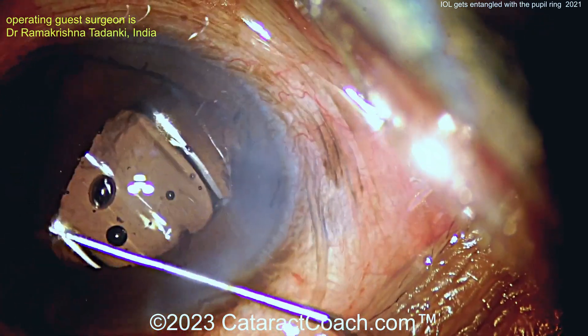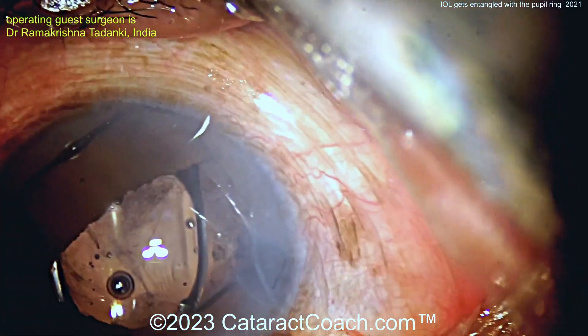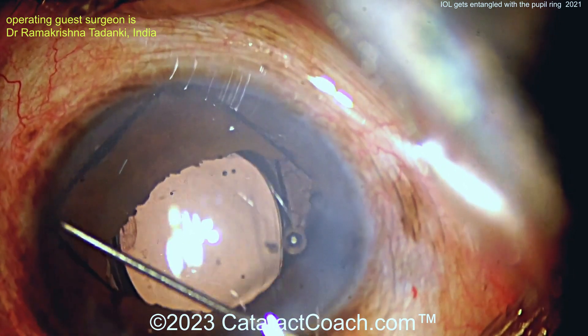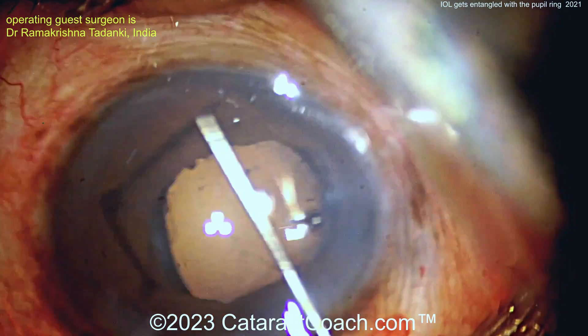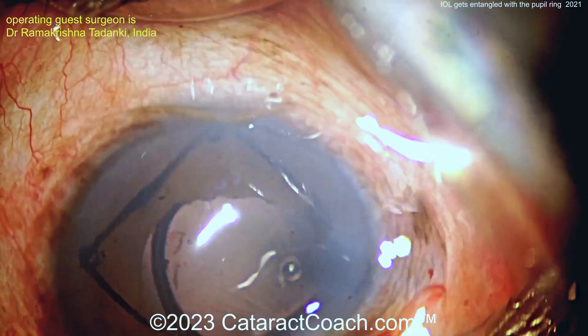Now as you try to remove the ring, as you rotate it, the IOL is spinning. For sure it's caught up in there. The trailing haptic got caught up in the expansion ring — it's stuck on that lens.